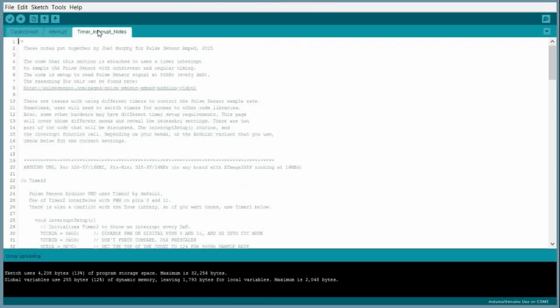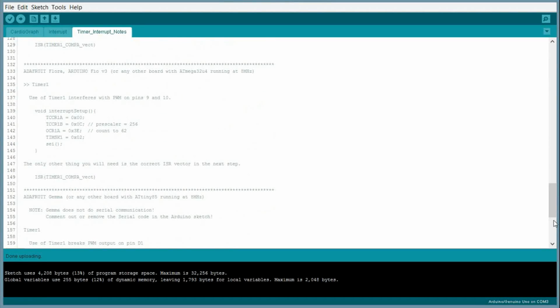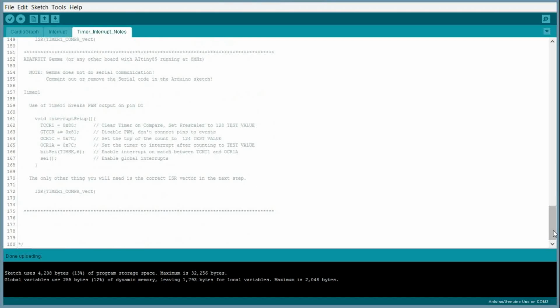And this is just the timer interrupt notes. It's just a page of comments, really. So you really don't even need this at all. But if you want it for reference, it's there.